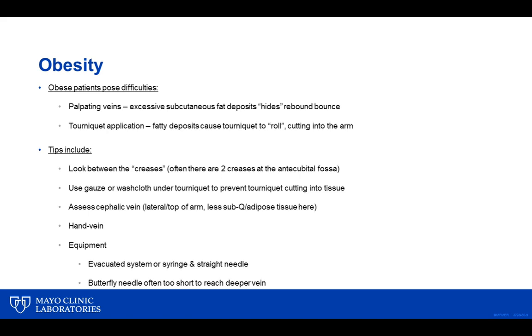And oftentimes, as Danny said, when you pop a tube on and you get a sprinkling or a little flash spray of blood in the tube and nothing more comes, that's a prime indicator of moving through the vein with the needle, because as you enter the vessel, the lumen of the needle will fill up with blood, and you pop that tube on, and that vacuum will pull what's in the needle into the tube, and when you don't see any more blood coming, that's a tip for you to slowly start pulling the needle back, and then once you see blood start entering the tube, anchor down with your device and complete the draw.